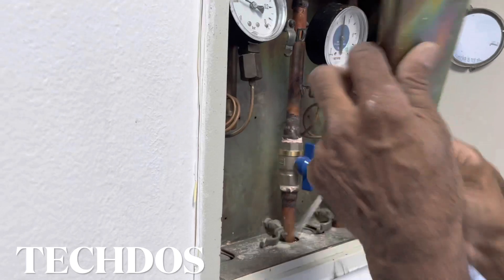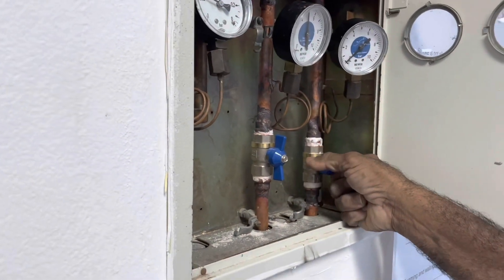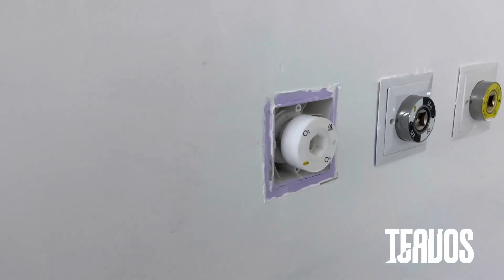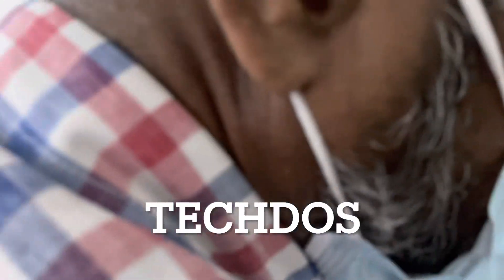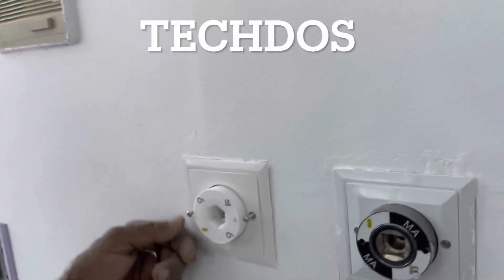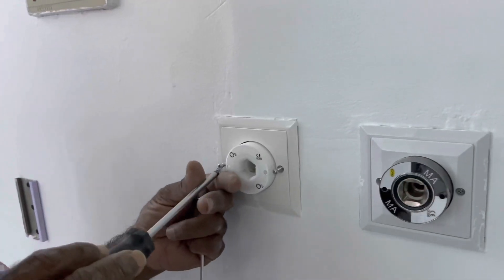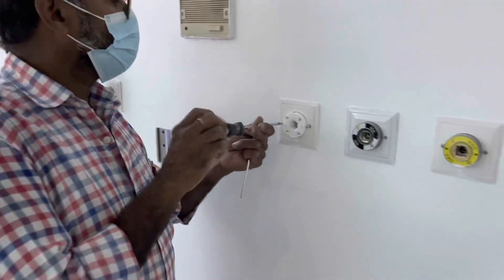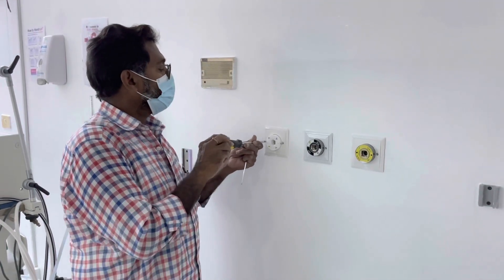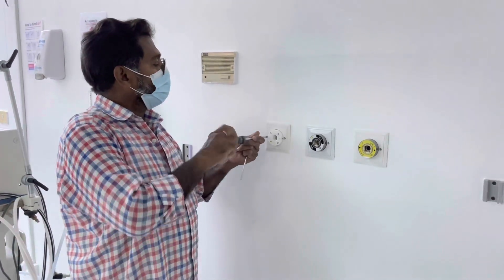Open the valve to test the pressure and check for leakage. Then install the outer cover to use the outlet. Bring a humidifier to test the pressure and check for any leakage.